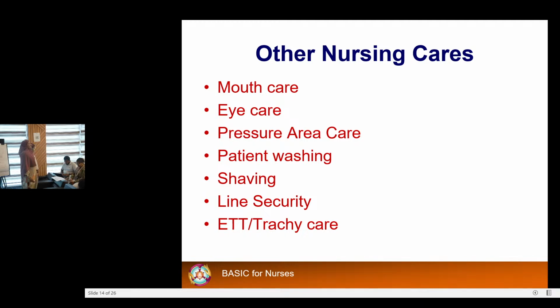Central line care. Line security, that's what I mean, central line care, line security. Tangu siku unamwekea, si unaandika pale umeandika siku gani. And then after a week or 3 days, 4 days, you can change it.